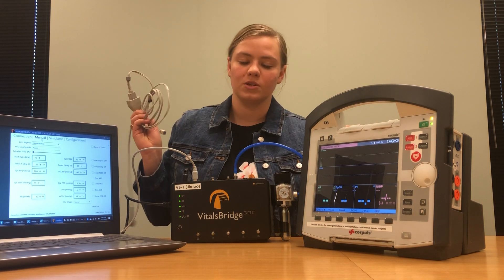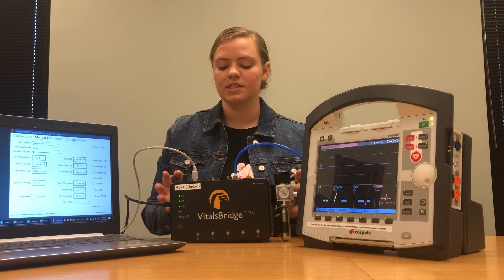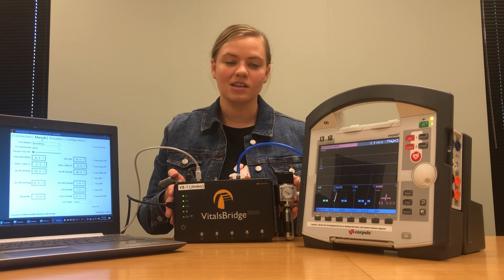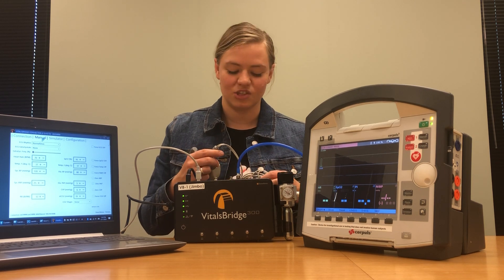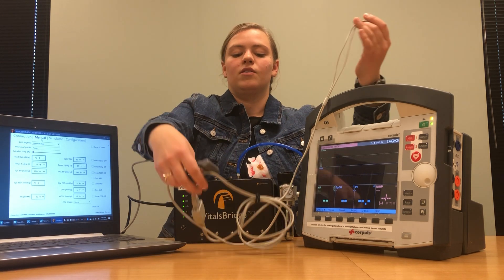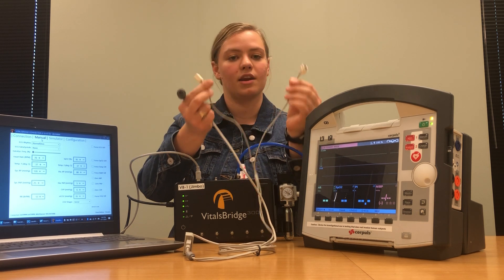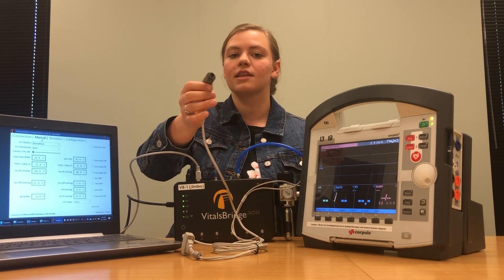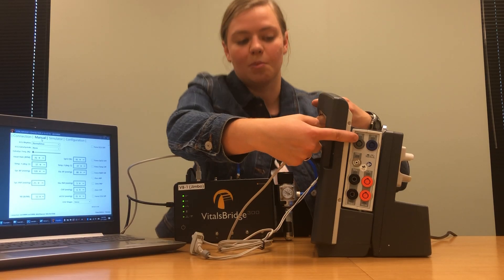This particular Core Pulse monitor is a mainstream capnography unit and this VitalsBridge has been configured to work with mainstream. If you want to use a sidestream unit, contact support at vitalsbridge.com to learn how to configure your unit for sidestream. The cable that comes with the Core Pulse patient monitor for capnography has one end that connects to the patient monitor and another end with two boxes that have triangles on one side. Take the end that connects to the patient monitor and plug it in where it says CO2 on your patient monitor.